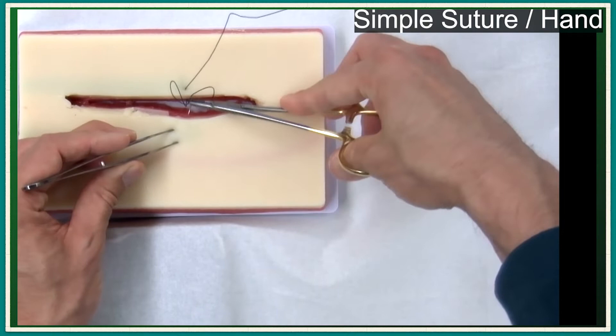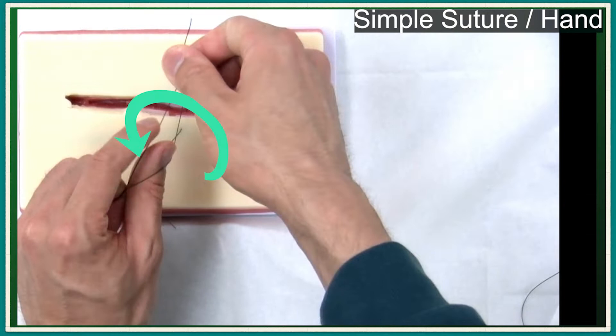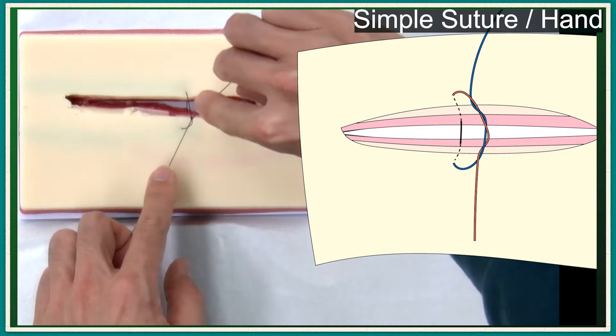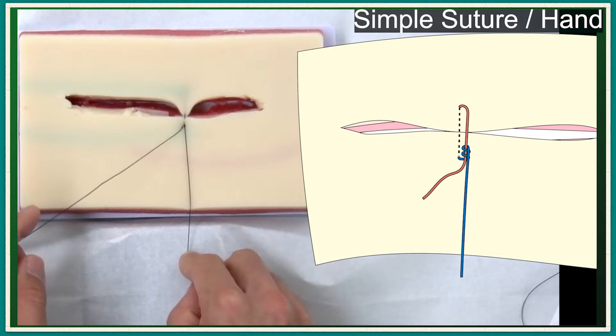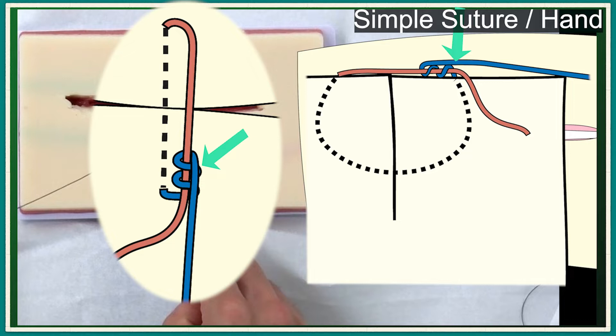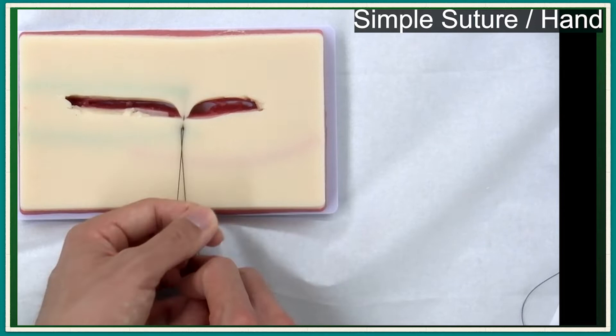The suture knot can be locked by the same procedure more efficiently. Form a suture knot by adding another knot after two-handed knot tying. Set the suture tension. Bring the right hand back and pull downward. The knot is locked. Because the locked area is larger than in simple suture, the tension is locked more efficiently. The additional knots are added by the left hand.